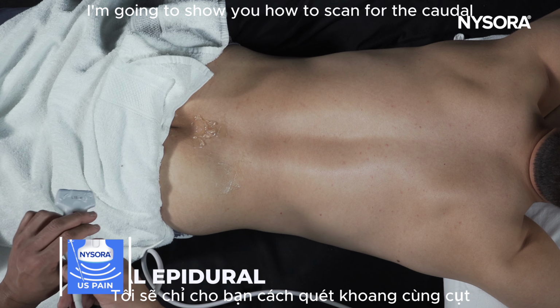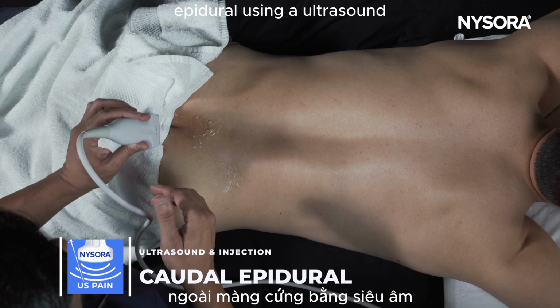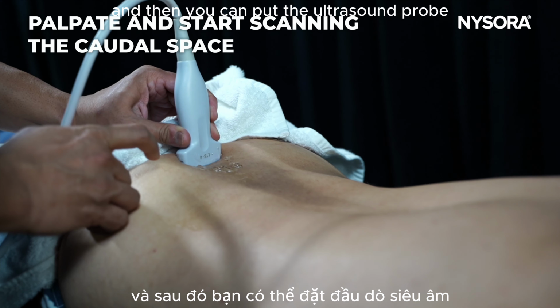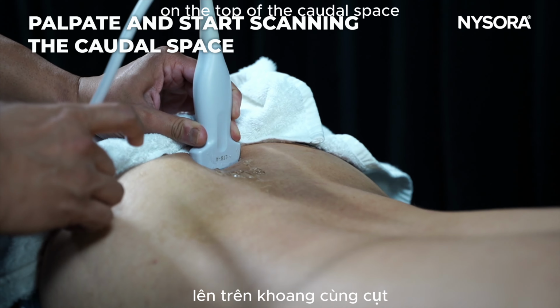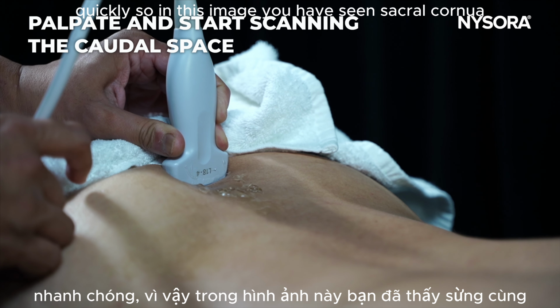I'm going to show you how to scan for the caudal epidural using ultrasound. You could palpate for the caudal space, and then you can put the ultrasound probe on top of the caudal space. That's another good way to actually get to the structure quickly.